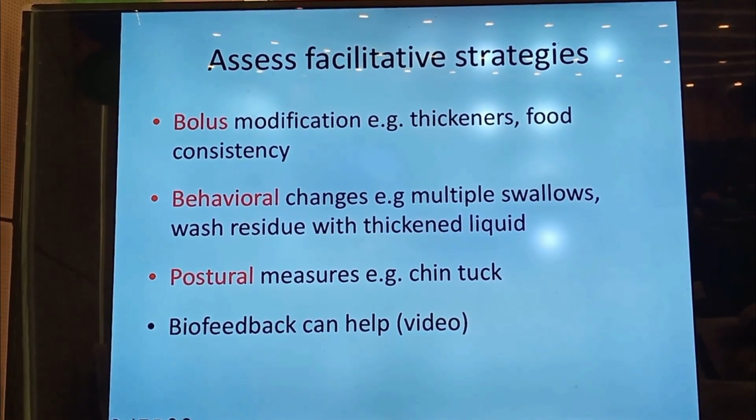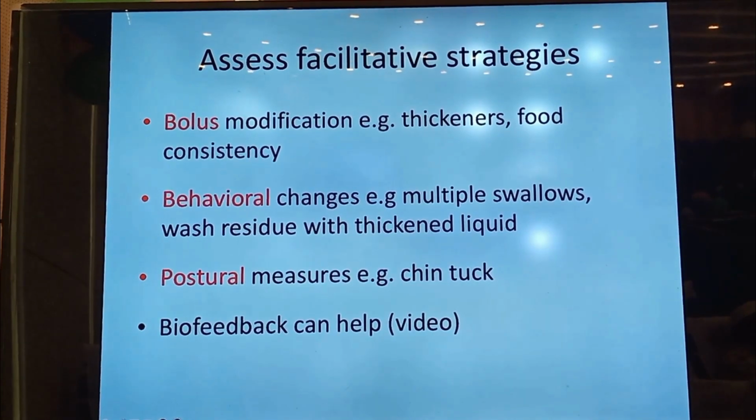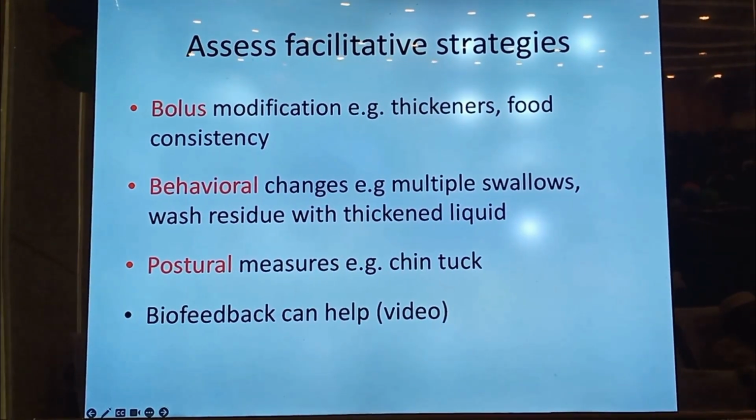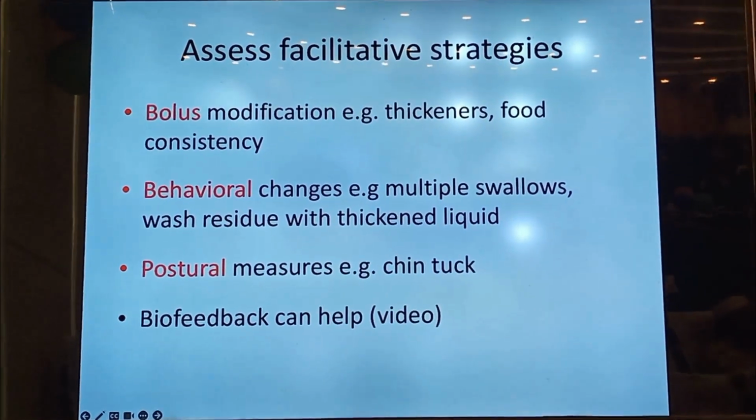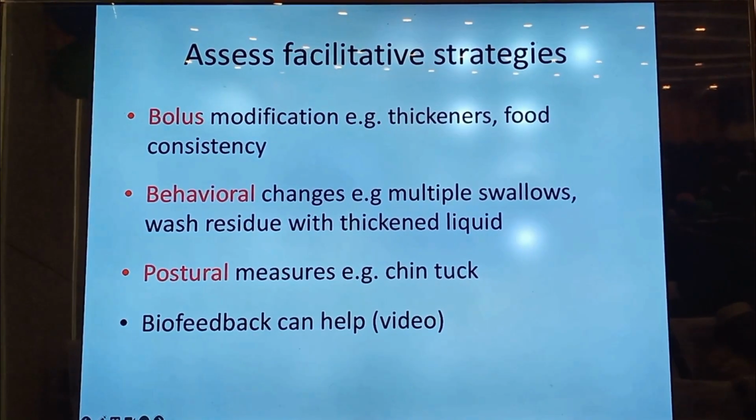And when I perform this examination in the clinic, the patient and the family are actually watching the examination on the screen, and the biofeedback can be very helpful, both for the patient as well as for the family and the caregivers.